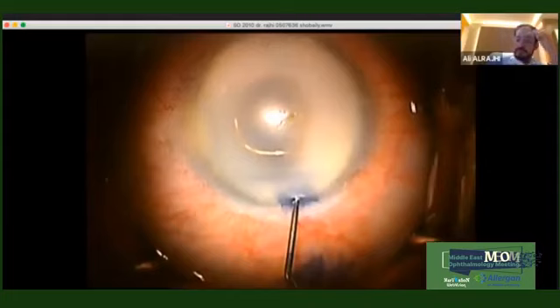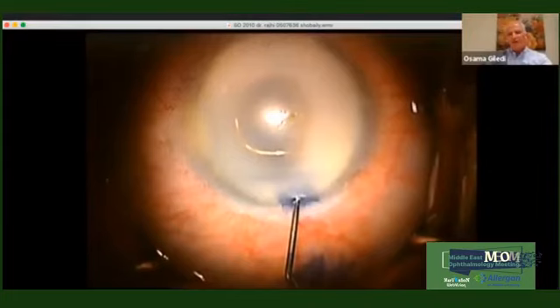One comment, it's very important when you do cataract surgery to always examine the cornea all around for any scar or thinning area. So always try to make the incision avoiding that area. Sometimes we go to cataract surgery straight without documenting whether there's any area of thinning. So if there's any area of thinning, always try to avoid it when you do the cataract surgery.